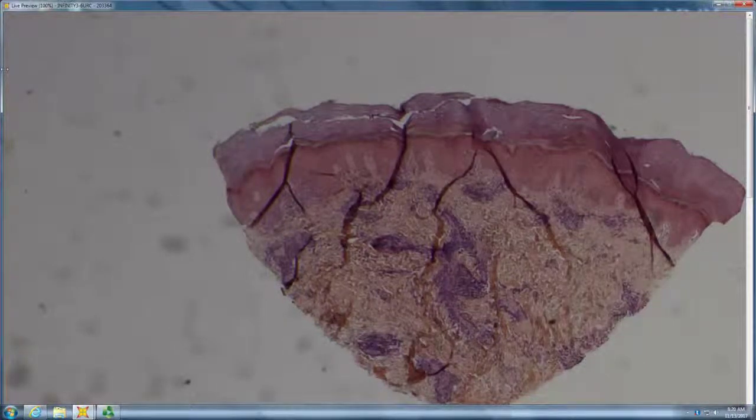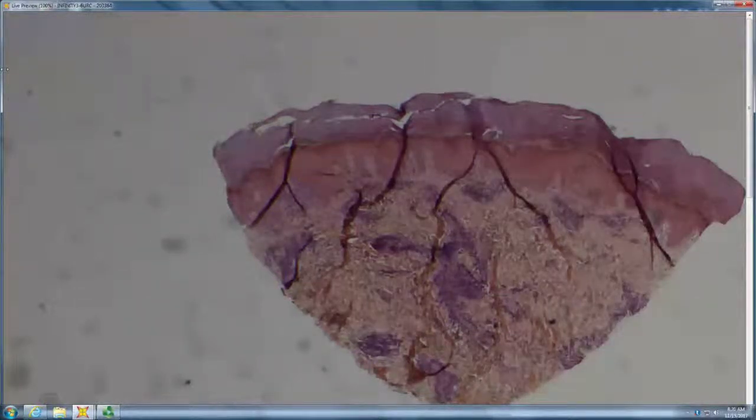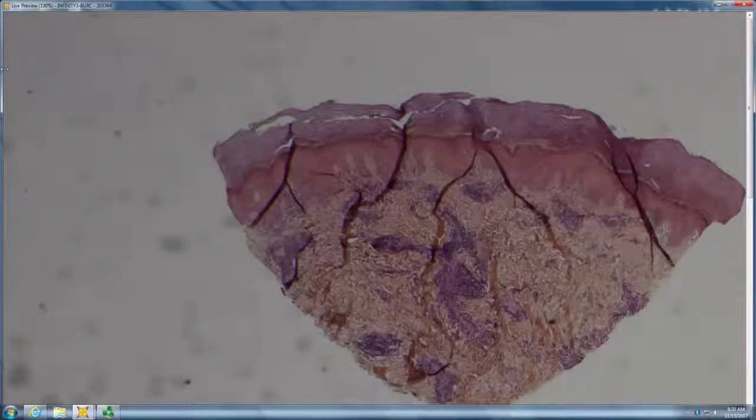So it's a pretty superficial infiltrate. Pretty superficial, meaning is that vessel predominantly involved, or is that vessel predominantly involved? So I'd say it's probably in the capillaries. So it's a capillaritis, and it's neutrophilic or lymphocytic? Lymphs. So it's a lymphocytic capillaritis, and there is red stuff, which are RBCs, and there are tiny little bits of brown stuff, which is probably hemosiderin. So this is PPD.